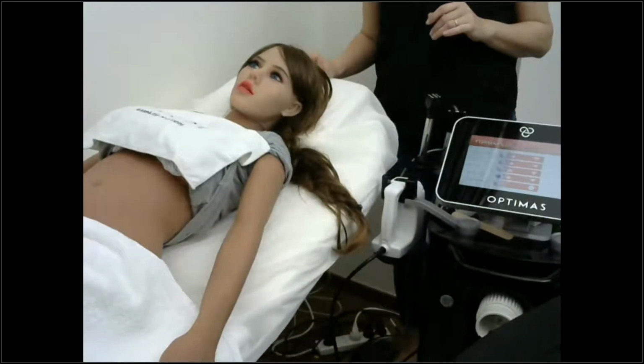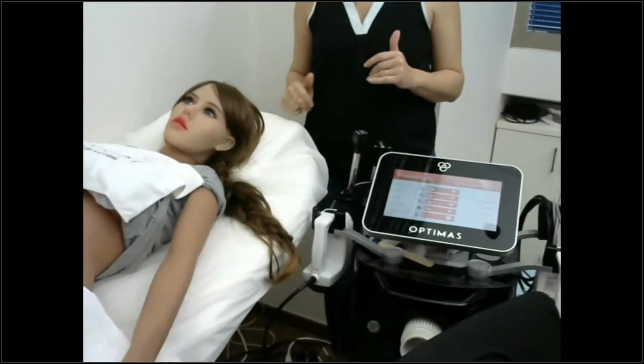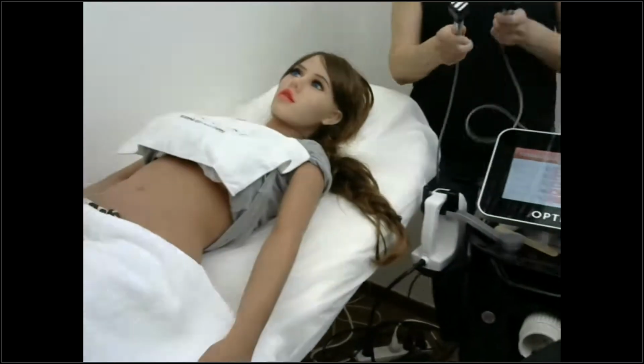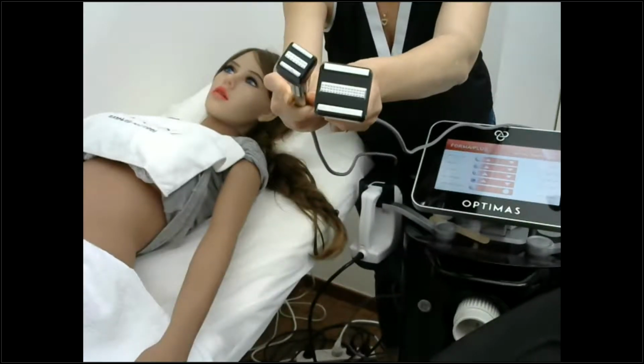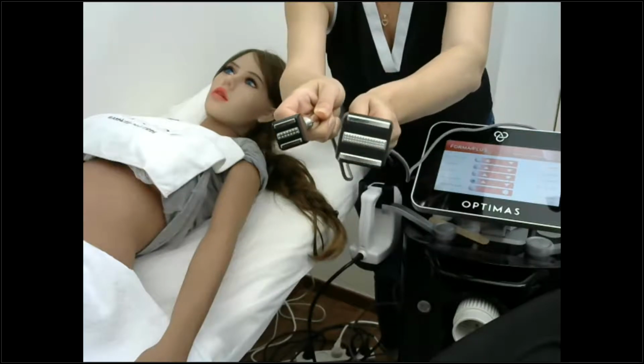As always, I will try and demonstrate a treatment that is as close as possible to real-life treatments. I will start with the Forma applicator. I will put them one next to another for you guys to see the two different applicators. So Forma, the smaller one, and Plus, the bigger one.